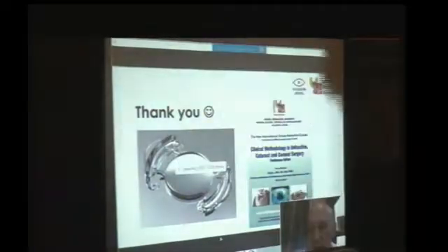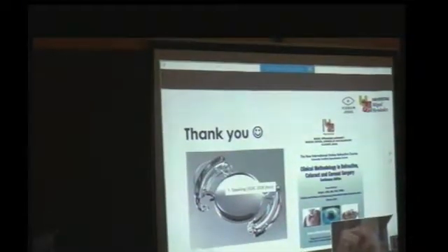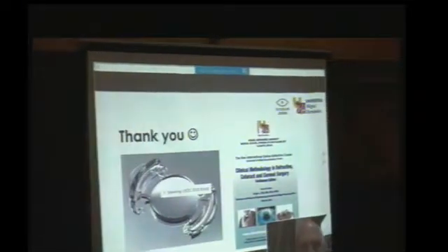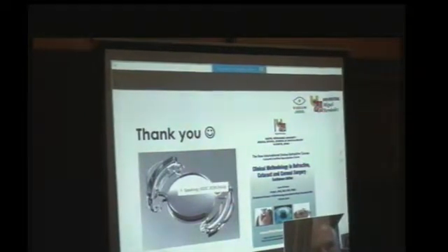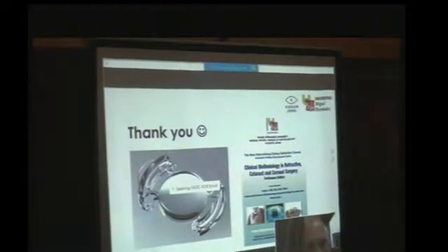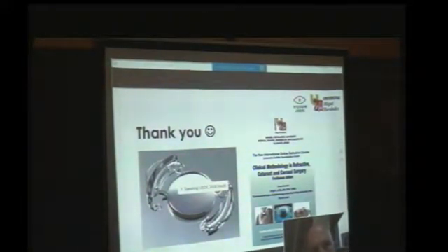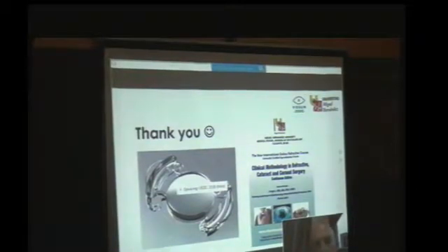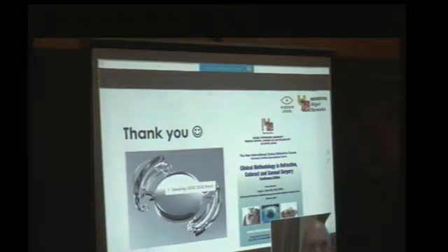I have just a couple of questions. First one, is there any contraindication for this type of lens, like a shallow anterior chamber or something like that? Well, at this moment, this is still a clinical study, so with the selection of the patients, those with extreme conditions, for instance, very elongated eyes or very short eyes, are not included in the study. Patients with a very narrow anterior chamber have a different configuration of the angle, and also a different configuration of the sulcus, and we are not including them.